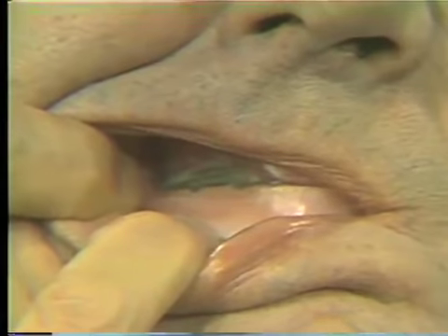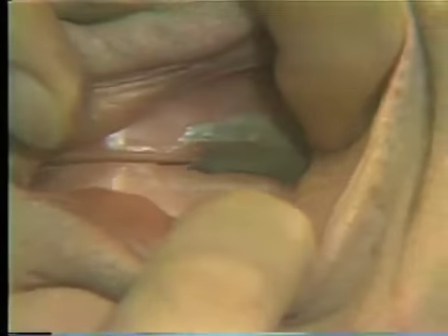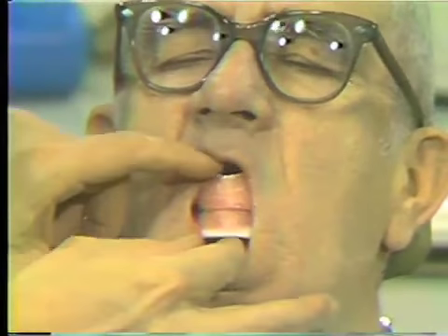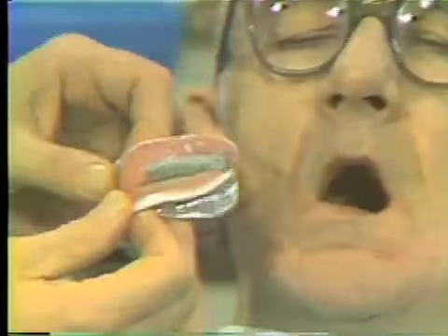Now we'll place these back in our patient and check to make sure that we are exactly in the same position. And again, Mr. Monahan, just squeeze. Now, as we can see, the grooves are completely filled. This side is completely together, exactly as it was before. We'll check the other side. Same situation. So we did not alter our soft wax. Now, open, Mr. Monahan. All right. We will now go back to our articulator.